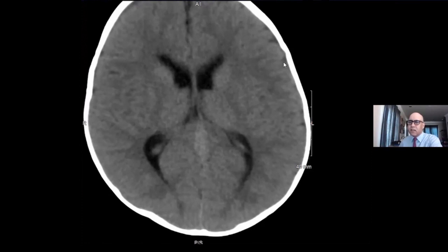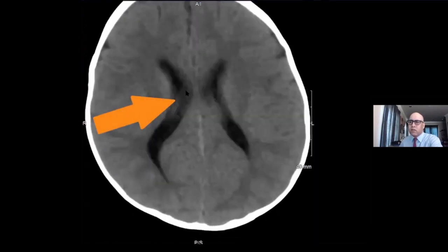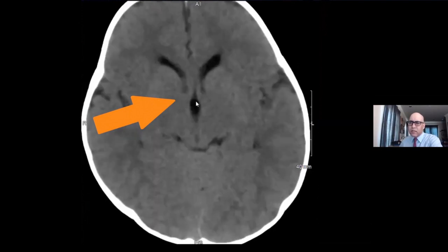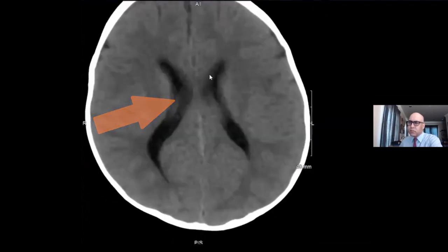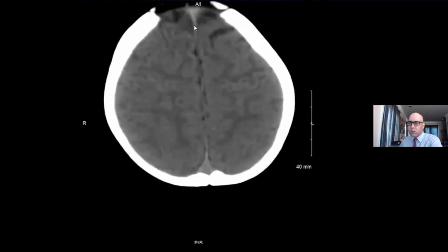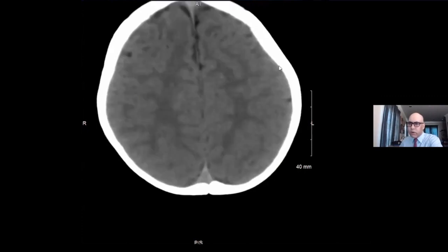This is a CT scan of the head in an 11-month-old child being performed for delayed milestones. We can see the lateral ventricles and third ventricle are upper normal in caliber, but this can be normal at this age. The rest of the head CT is looking fairly normal. We can see the anterior fontanelle remains partially open, which is appropriate for this age.